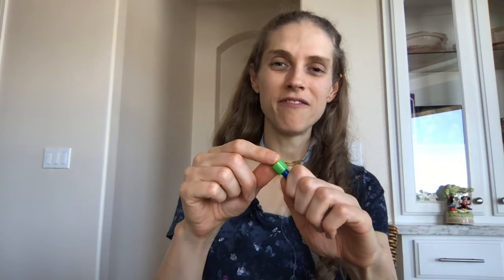When the heparin is done infusing, unscrew and discard the heparin flush — you are now done infusing your antibiotics. One last suggestion: use an alcohol disinfectant cap. Simply peel off the top and screw it onto the end of your line to help keep it clean and prevent infection. Remember also to clamp your line when you are done.